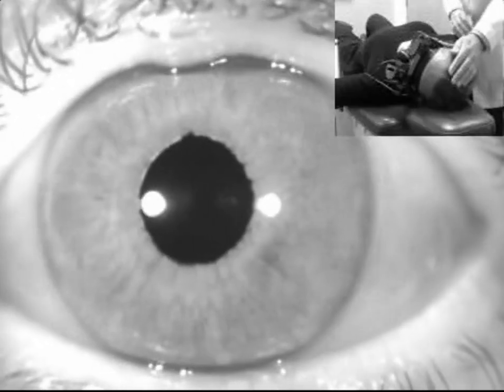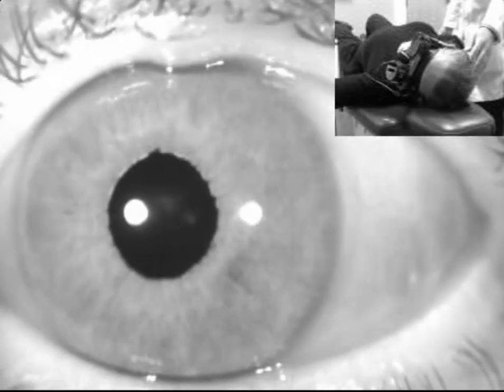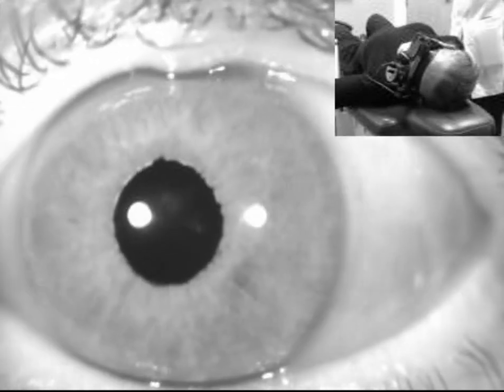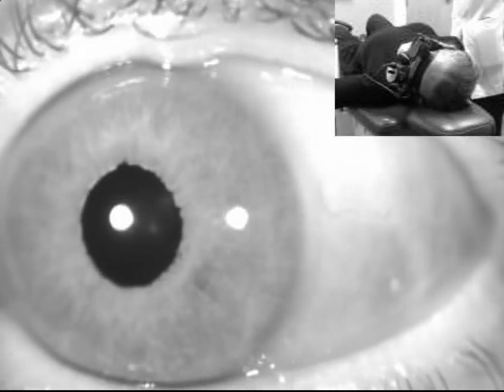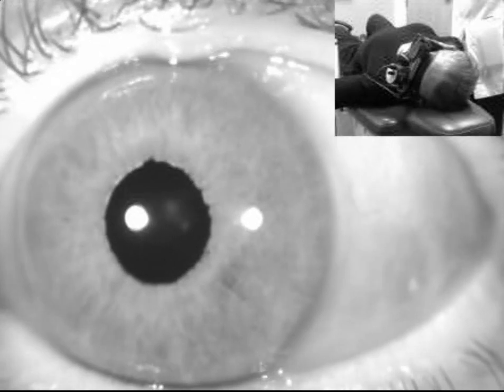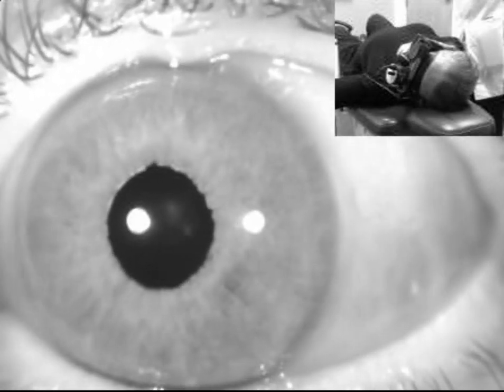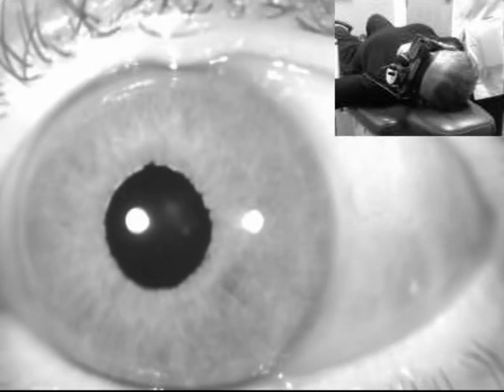There's quite a strong left-beat lateral nystagmus — this is geotropic. Let's see how long that goes before it stops. We have established that there's likely lateral canal disease. It seems to be tapering now. This is likely canalithiasis, but we do not know the side.